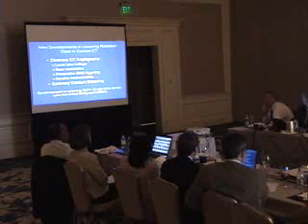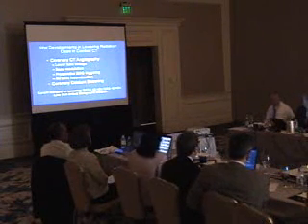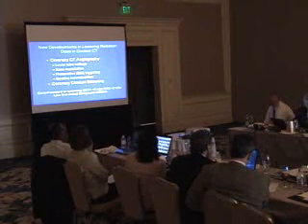So we're using a screening, 4 different scanners, 8 different sites. We have doses of 1.1 millisieverts on average, using 120 kV. We haven't gone down to the lower voltage yet because it changes the calcium score a little bit, and we're afraid to do that in MESA since we're following up patients. But the dose that will be reported from all of these multi-center studies for asymptomatic people is 1.1 millisieverts.